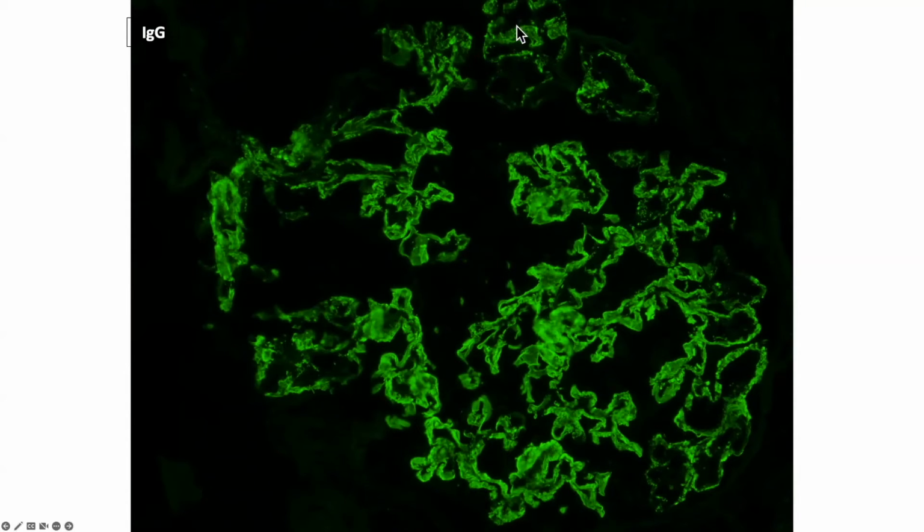I think in the rest of the glomerulus, it's so full of deposits that it gives an appearance of being linear. But the other thing too, David, is where are those deposits? We just know they're in the wall somewhere. Right. We don't know if it's subepithelial or subendothelial or even intramembranous. So the whole issue of membranous, as you were alluding to, Mel, might still be in play. I think the tram tracking leads you away from that, but the EMs will be helpful.